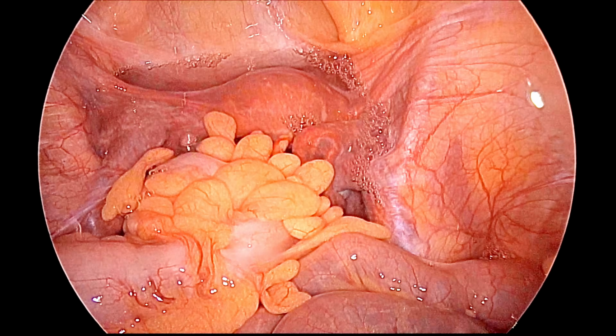So this is over. Thank you very much for watching this video. This was just a simple case of diagnostic laparoscopy together with hysteroscopy and tubal patency test.